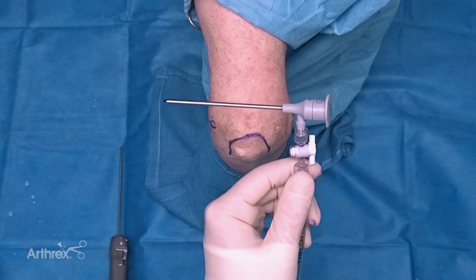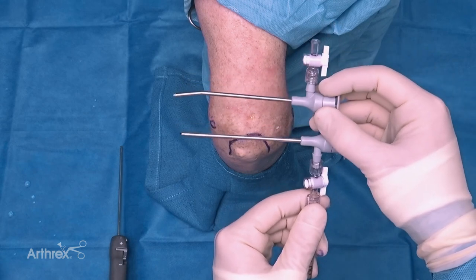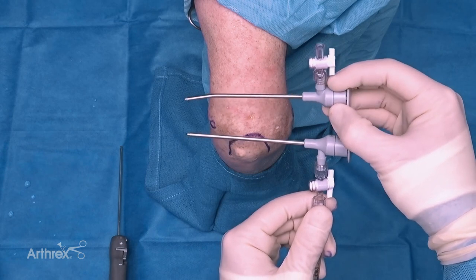For this we're going to start with a 3.2 millimeter high flow nanoscope cannula. You can see this comes in a straight orientation - it's also available in a curved orientation, which would allow you increased field of view so that you can rotate it as needed, similar to a standard scope.